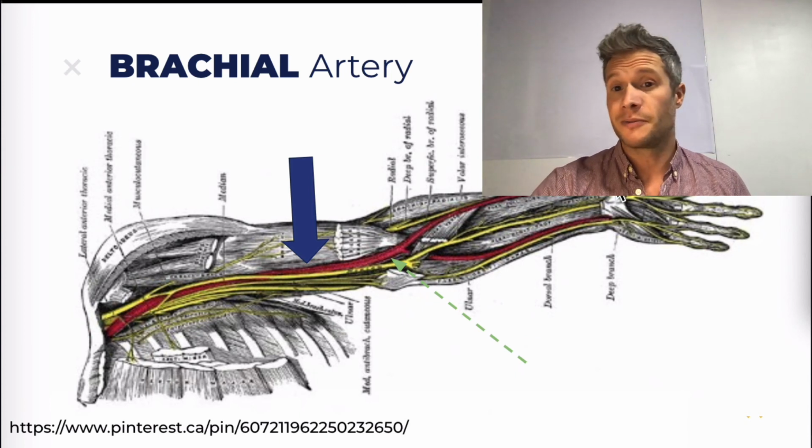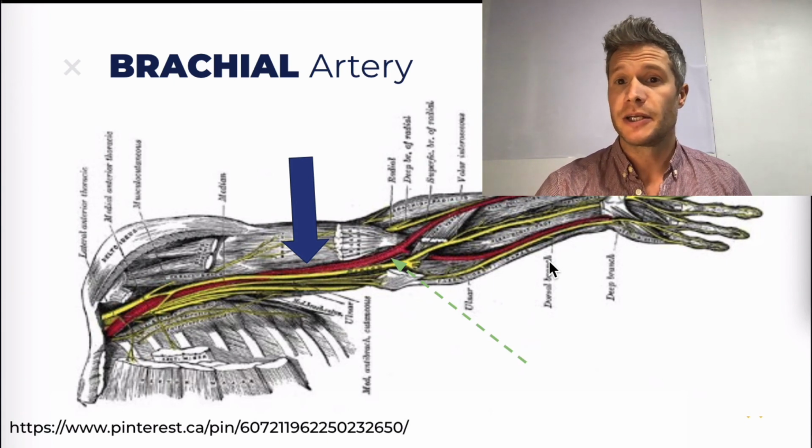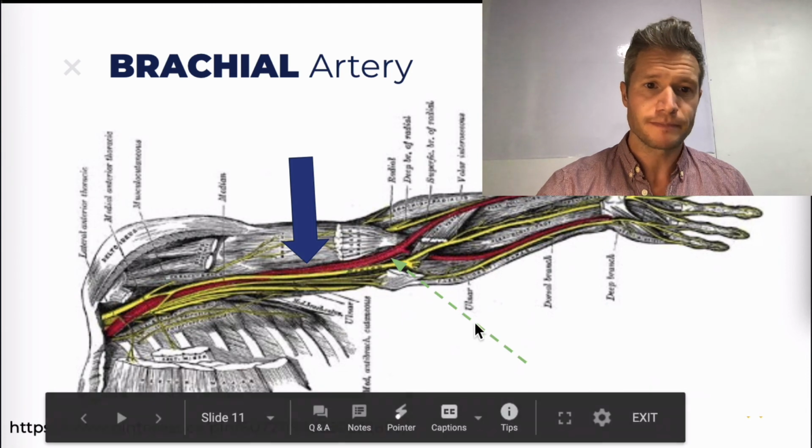Why is that? Well, you're going to be cutting off the blood flow to the rest of the person's arm, and that's not good. That can be painful. It can cause some damage, injure the person. So again, try to be mindful. If you're having the blood pressure taken to you, always speak up if you feel like your arm has had the blood pressure cuff on too long, okay?